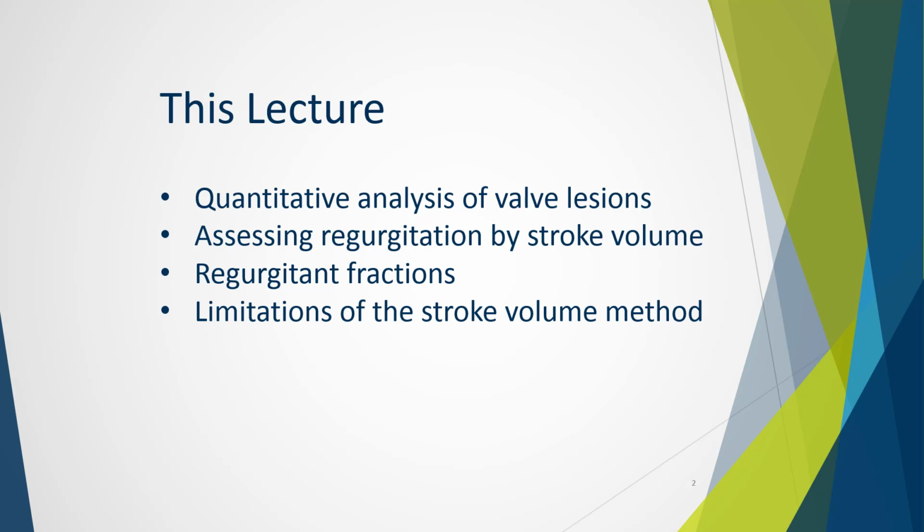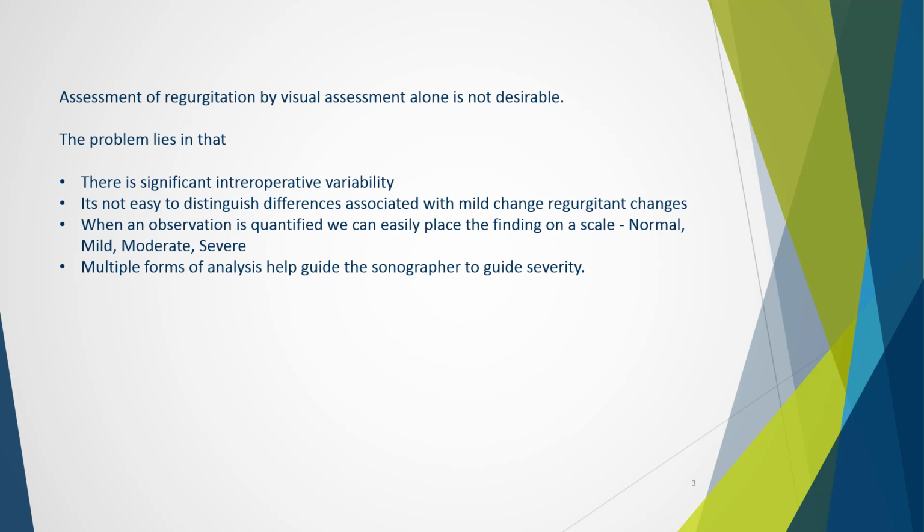As mentioned in previous lectures, there are inherent limitations, assumptions, and potentials for error in these formulas of evaluation, which we'll actually expand upon further. Evaluation of regurgitating valves is important in echo. We wish to investigate the severity beyond the basic visual assessment with color Doppler.